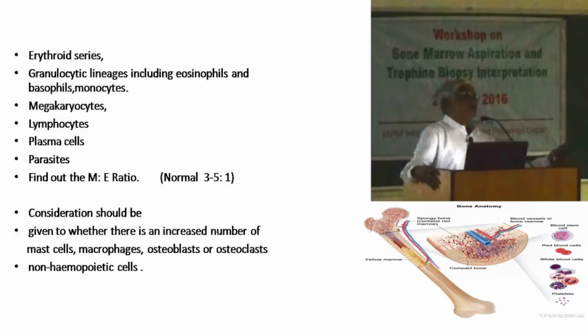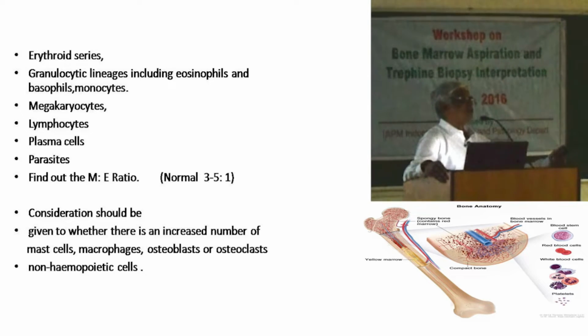In these particular smears, many a time I have seen necrosis. Only few books have described that, but bone marrow necrosis is a condition which has been described in few books, and in some books in few lines only. But that is also commonly seen. Not necessarily this will be associated with malignancies.